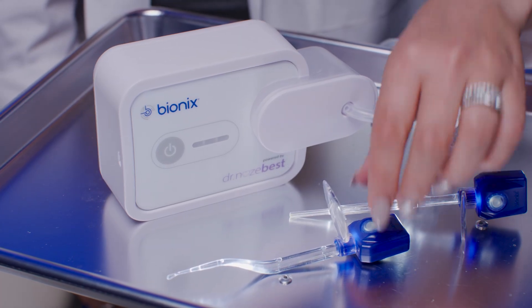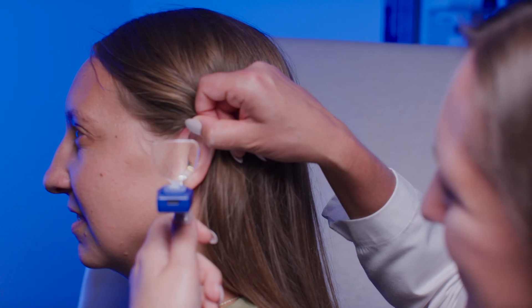If needed, use a Bionics Clear Look Lighted Ear Curette to gently remove any remaining cerumen or debris.